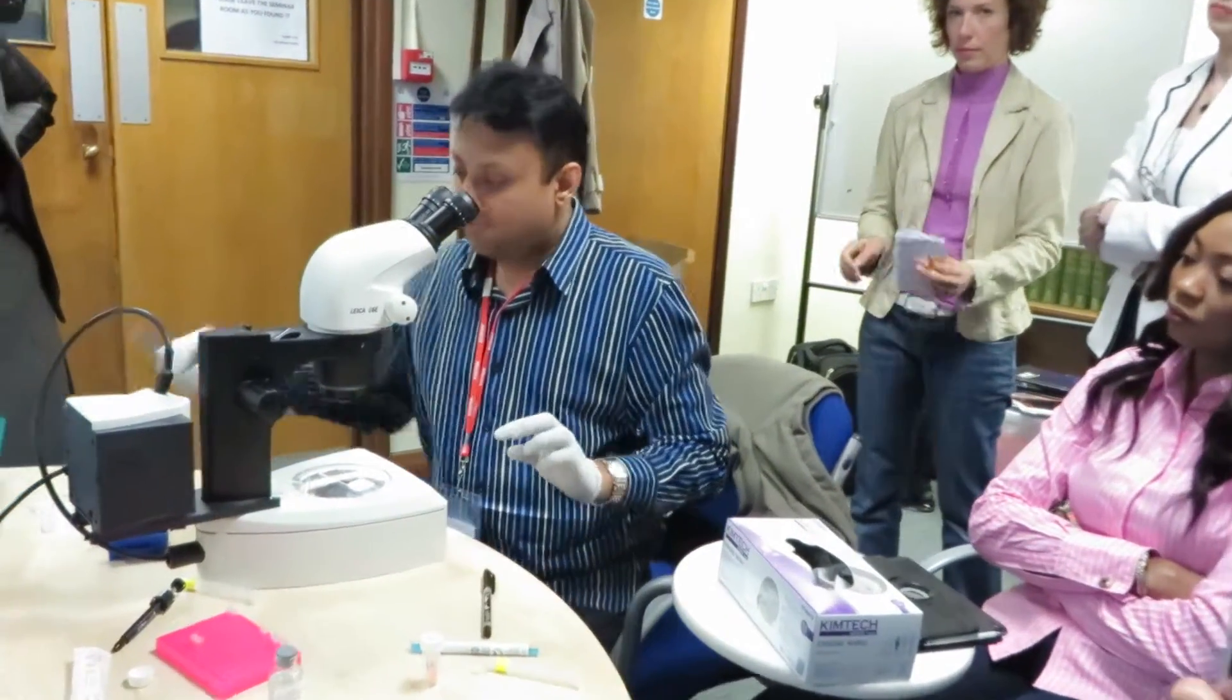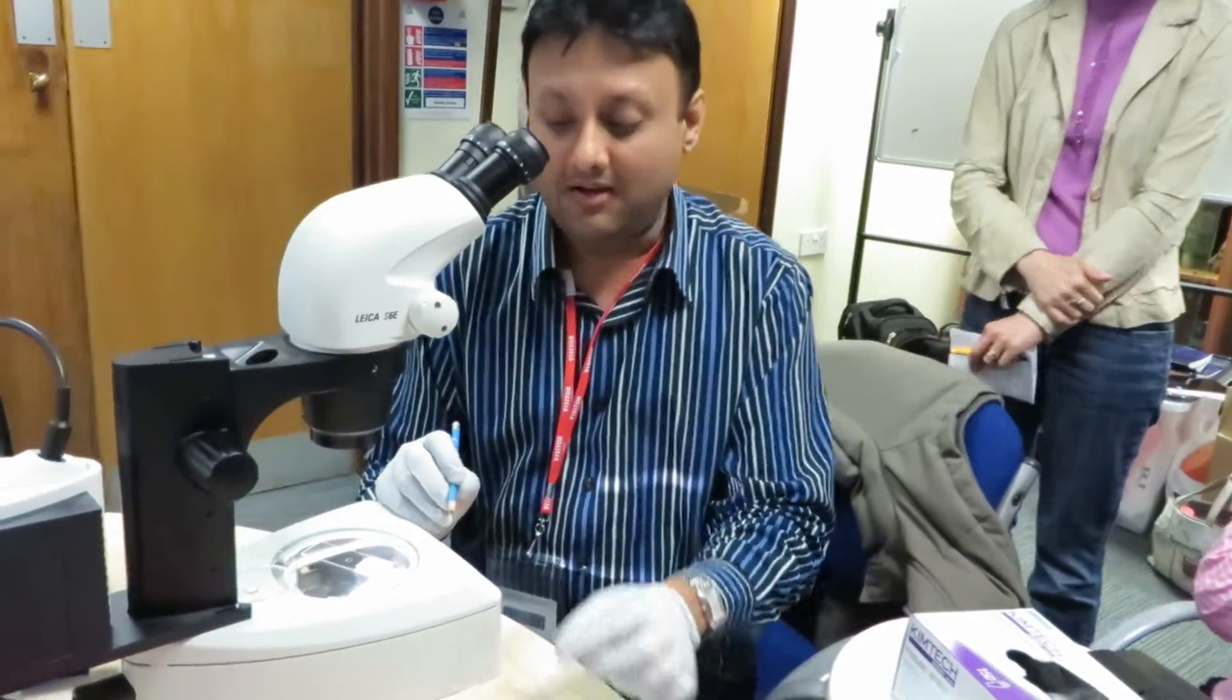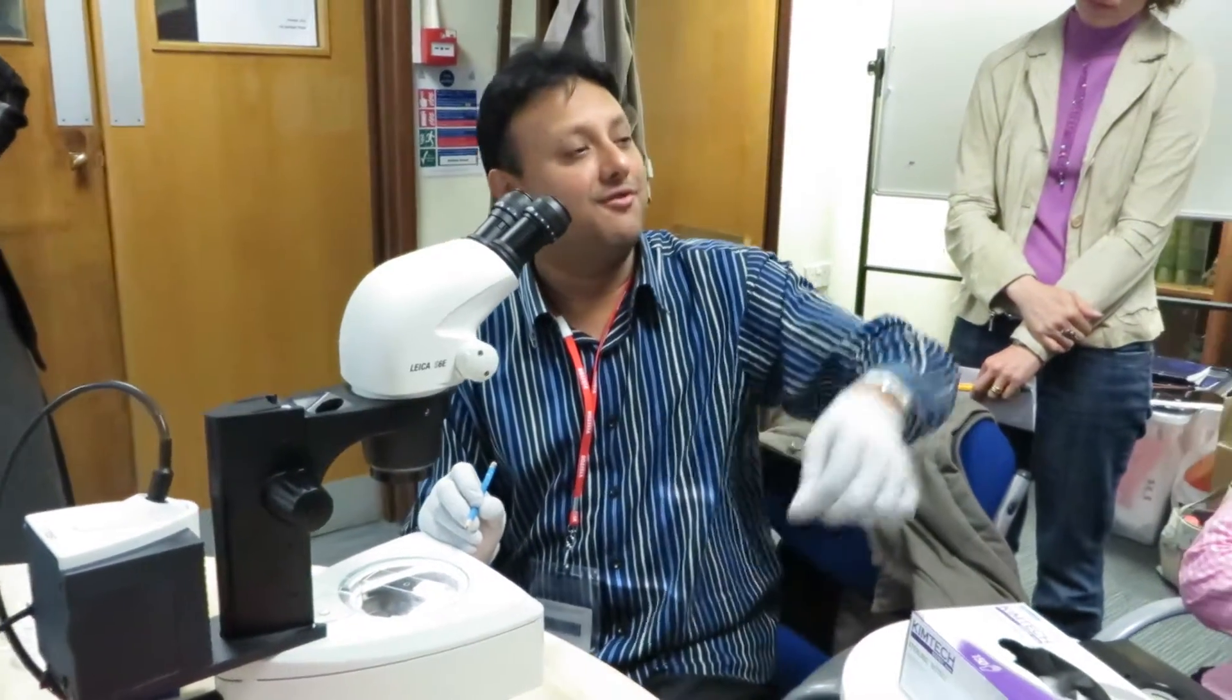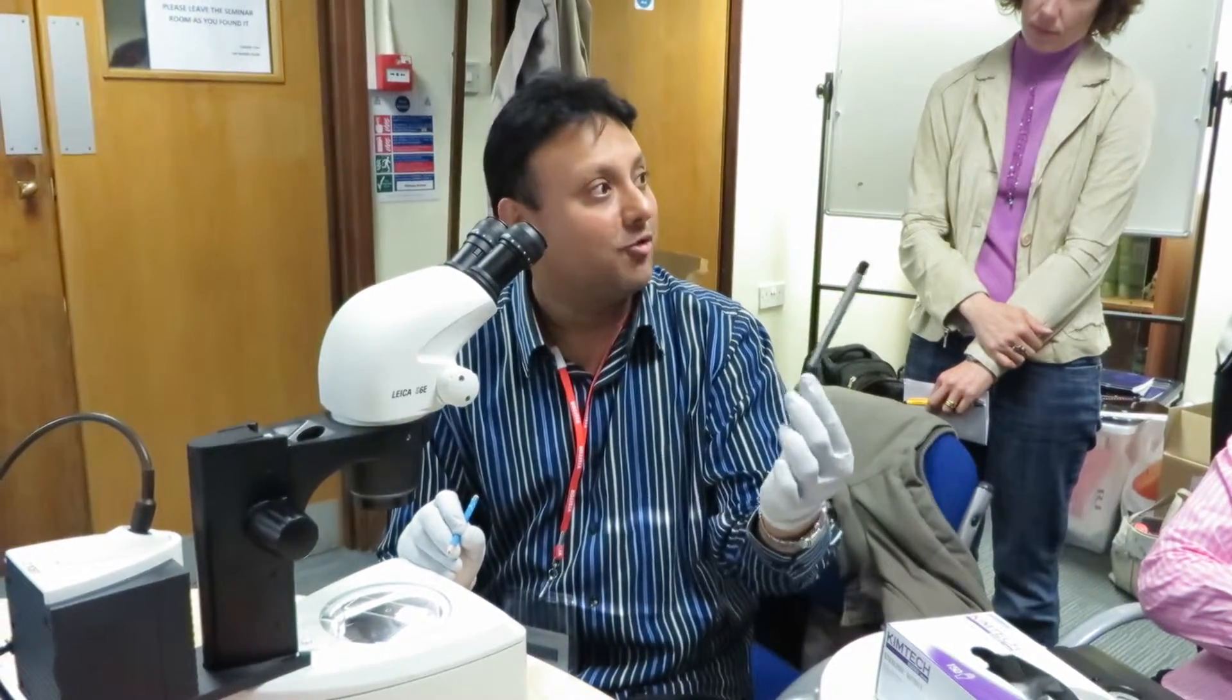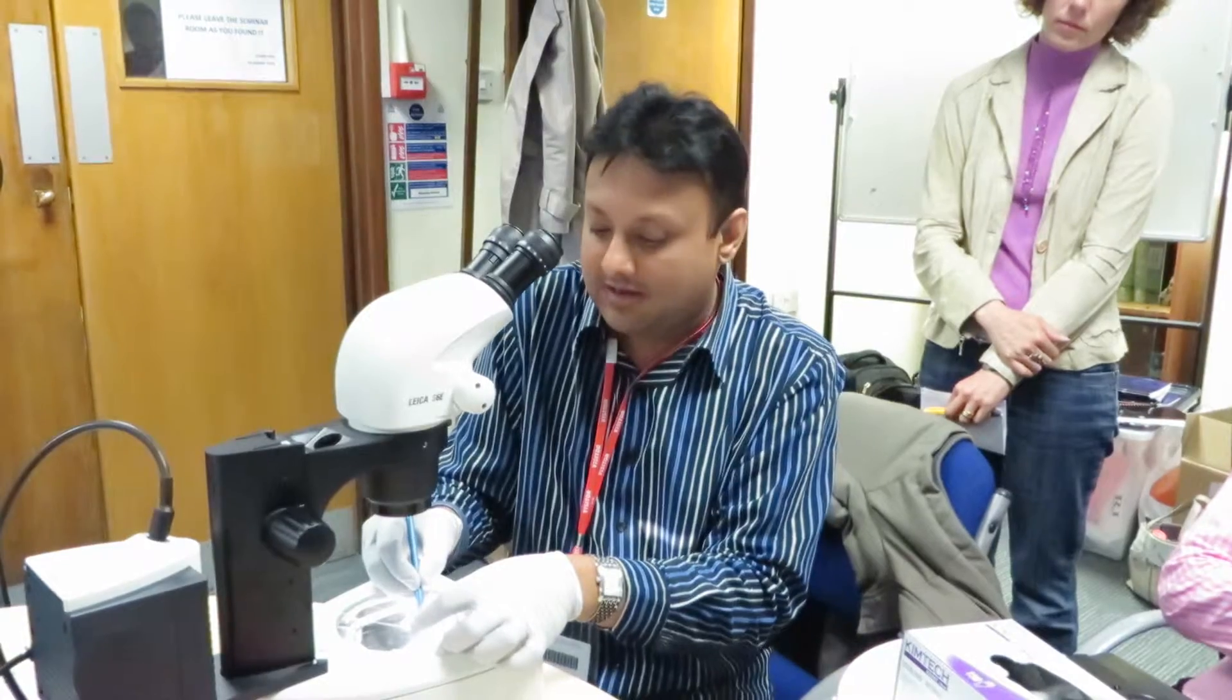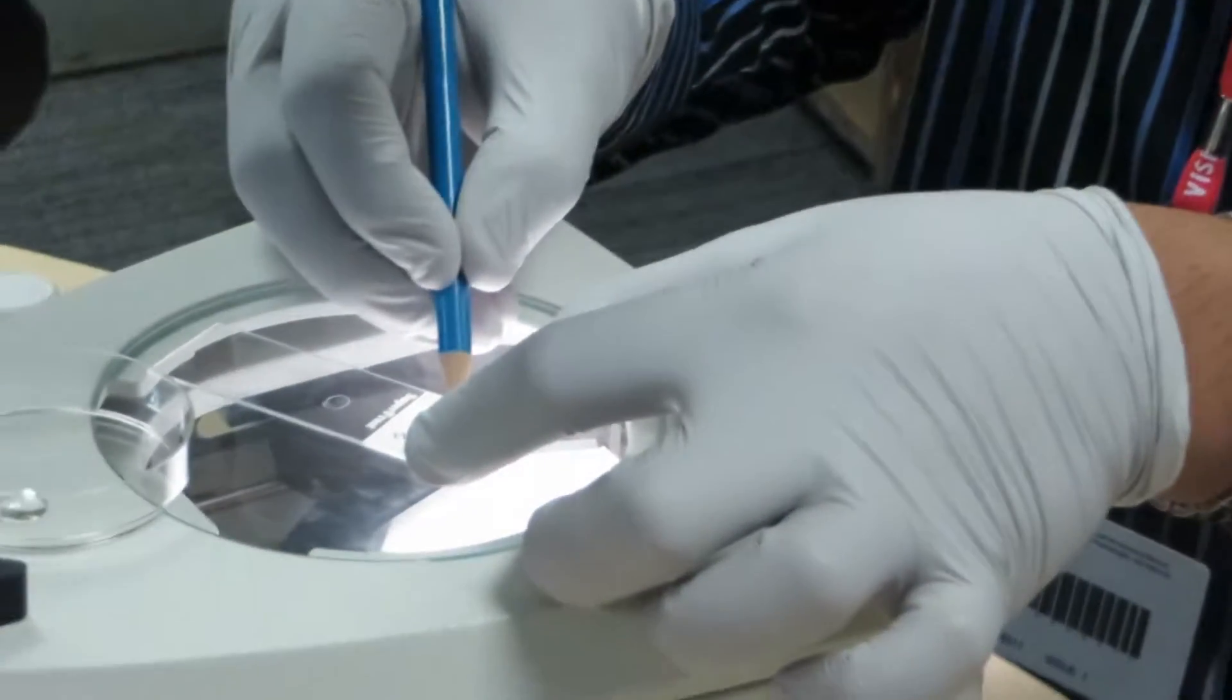Always label the slide in pencil because if you use an alcohol-based pen, during the whole dehydration process when they move the slides from 70, 90, 100 ethanol, the alcohol pen will wash off. So label it in pencil. The way to label it is the patient's name and embryo number.